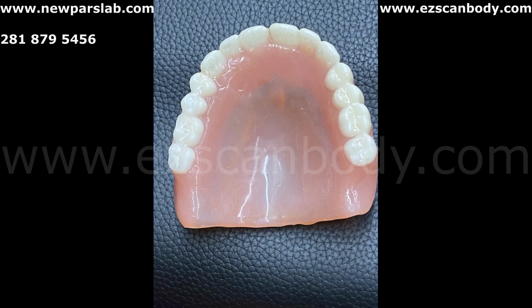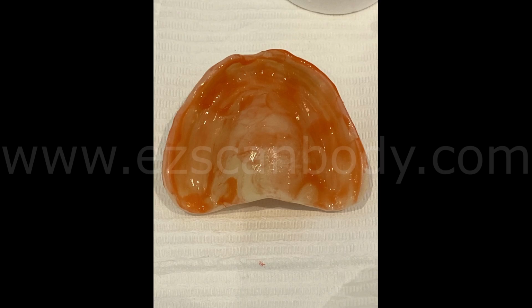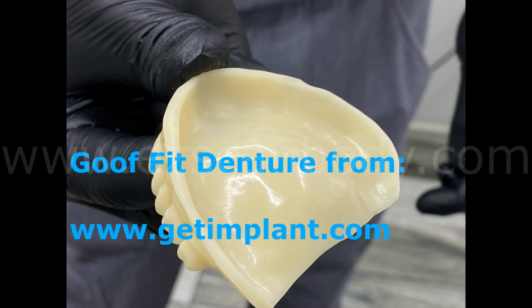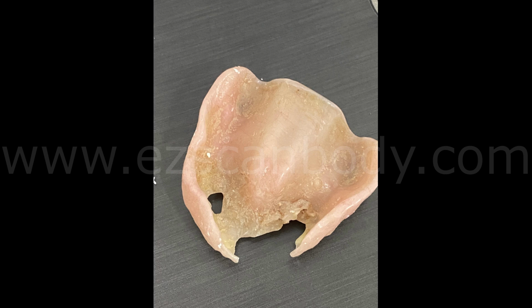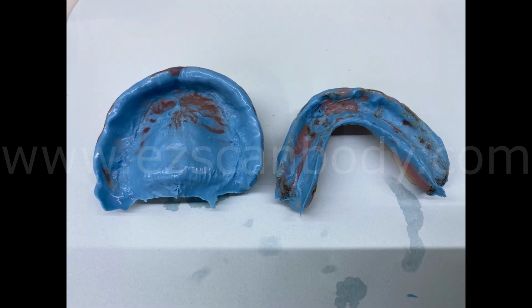To create a digital denture in a dental office, there are several important factors to consider. The first step is to decide whether to use the patient's old denture or a thermoplastic denture tray, especially if the patient doesn't have a denture or if the existing one is in poor condition. Choose the appropriate impression material and reline the denture if necessary.